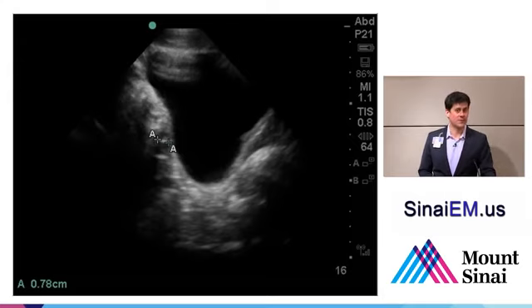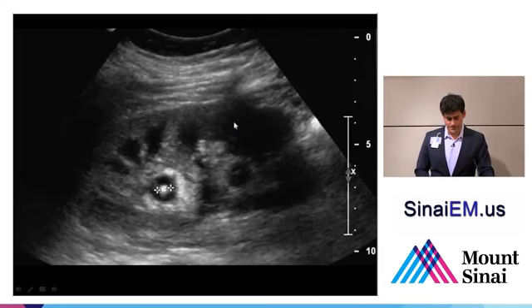The ureters themselves are very difficult to see on ultrasound, so typically the places you'll see stones, if you're going to find them, are going to be in the renal parenchyma itself, trapped in an area like the UVJ, or floating around inside the bladder. So here again we see a stone in the renal parenchyma itself. And don't be misled by these clinically. A lot of people have these and are asymptomatic. So just be cautious if you're going to point to all your patient's symptoms being related to renal colic because they have a stone in their kidney. It may not be the stone in the kidney that's causing them to have any pain, and without any evidence to have a stone somewhere else, a broader differential should be considered.